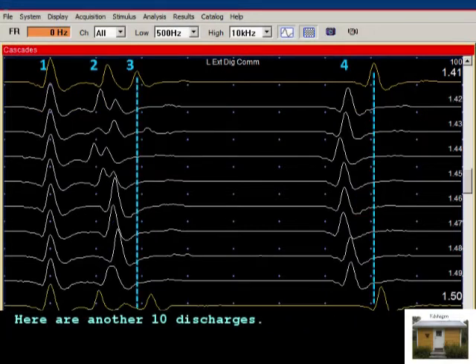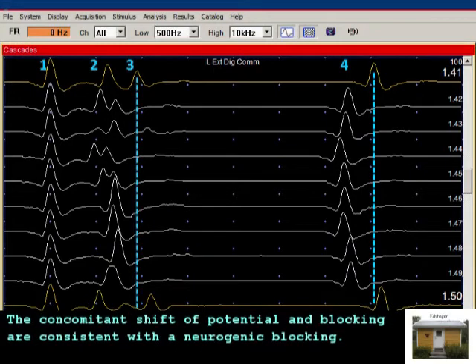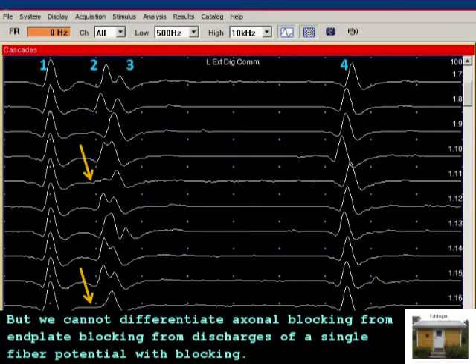Here are another 10 discharges. On the top and bottom traces, potentials 3 and 4 shift right together. The concomitant shift of potential and blocking are consistent with neurogenic blocking. The blocking in potential 2 could also be due to lesion in an axon. But we can't differentiate axonal blocking from end plate blocking from discharges of a single fiber potential with blocking.